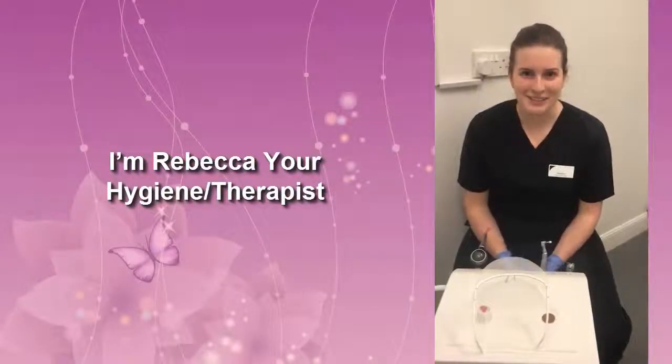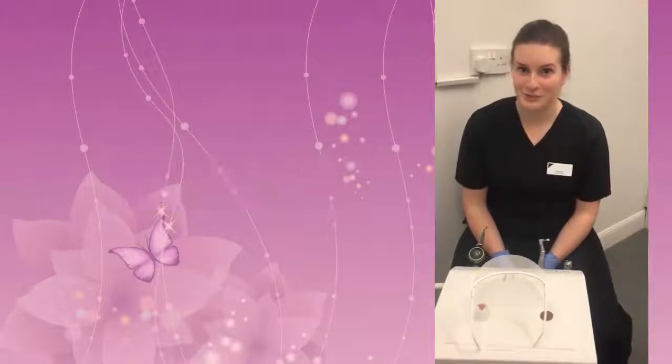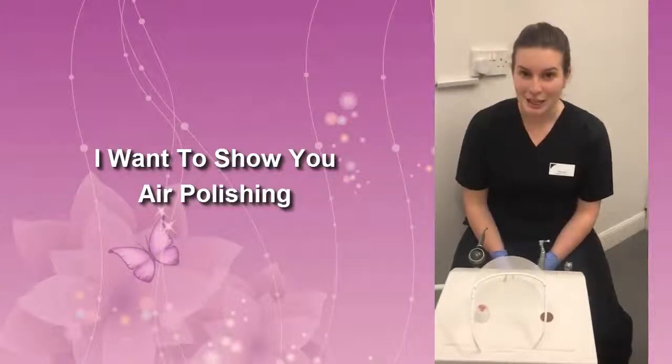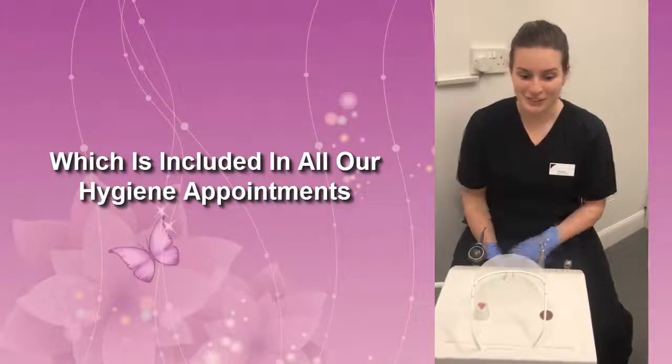Hi there, my name is Rebecca. I'm a dental hygienist and therapist here at Dentistry on the Clyde, and today I'm going to show you the results that we get with our air polishing. The air polish is included in all of our hygiene appointments, so if you would like to book in, just give us a ring.